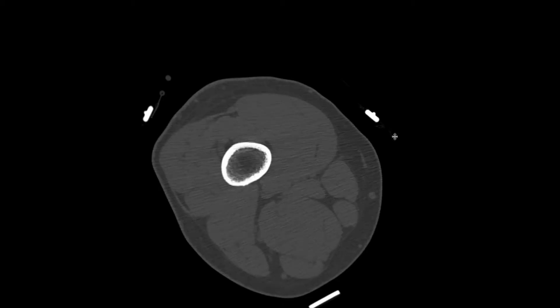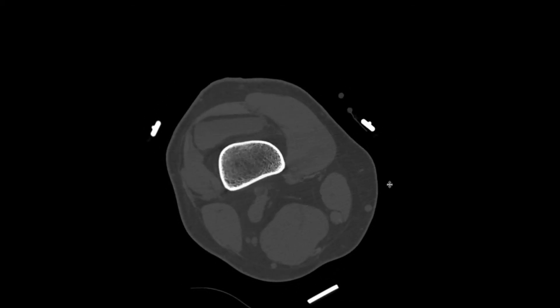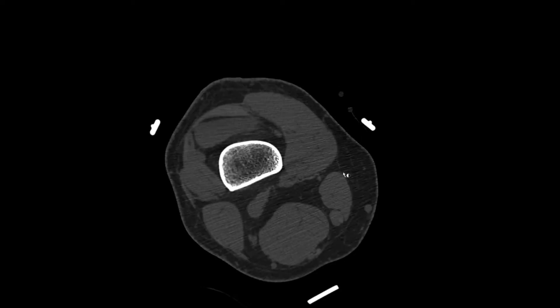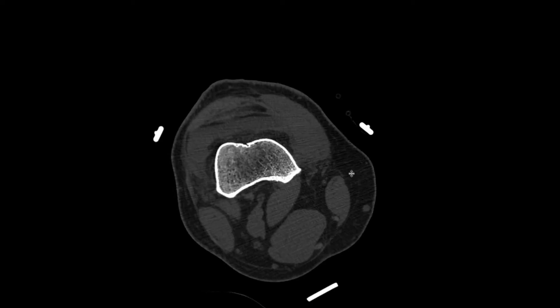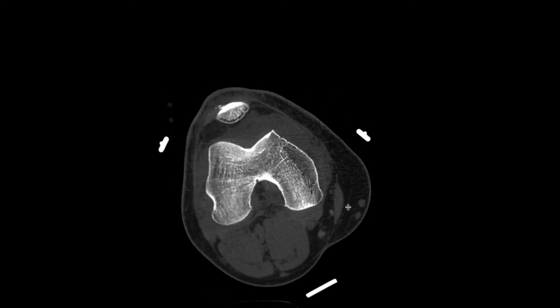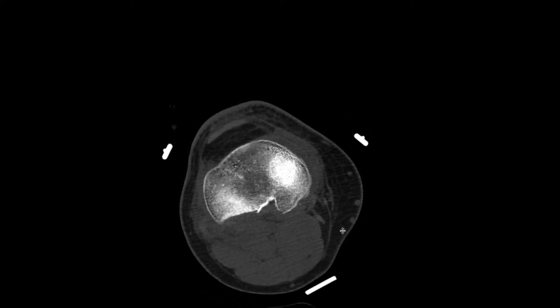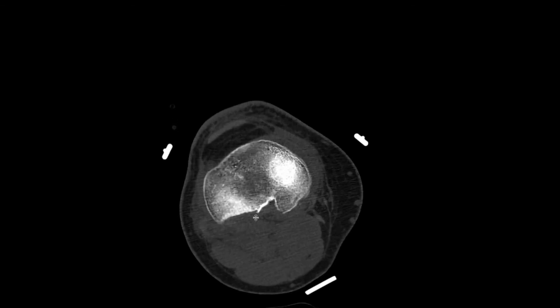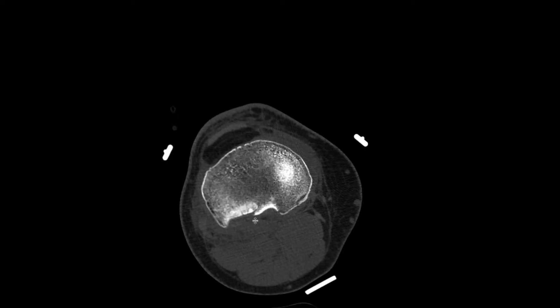This patient went on to get a CT. We have axial CT slices in the bone window, with redemonstration of the lipohemarthrosis in the suprapatellar region. As we go more inferiorly, passing through the patella, femoral condyles, and down to the tibial plateau, you can see in the lateral aspect there is an acute cortical step-off. We've also got increased density of the trabecular bone just underneath that, representing impaction.